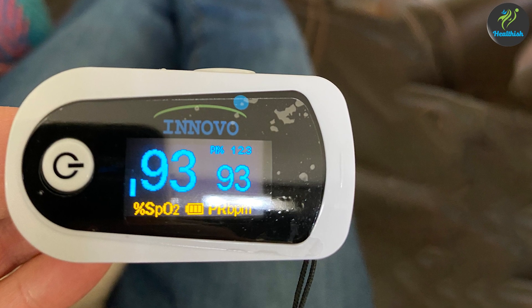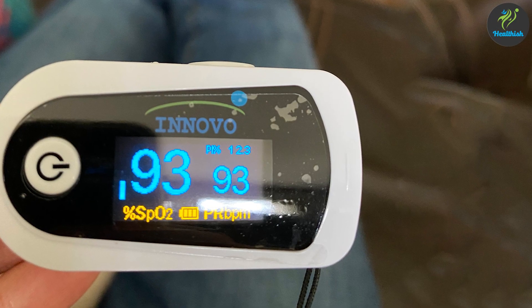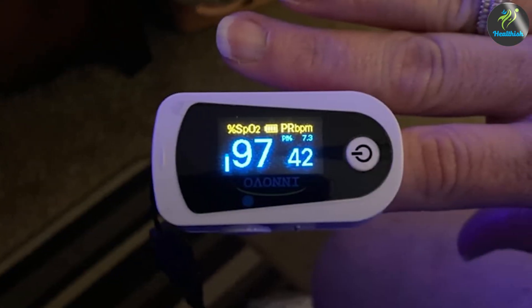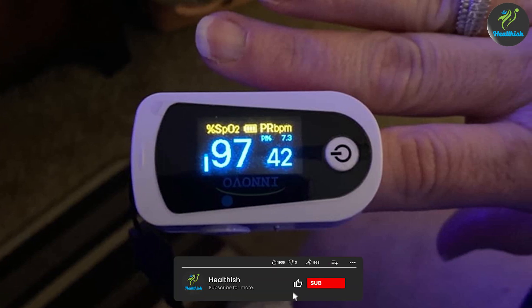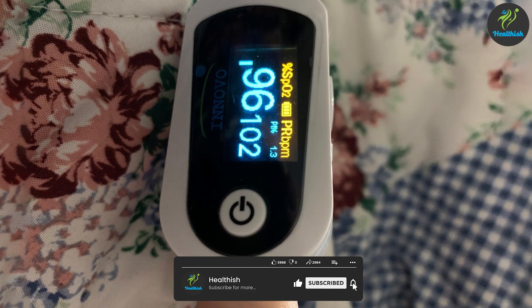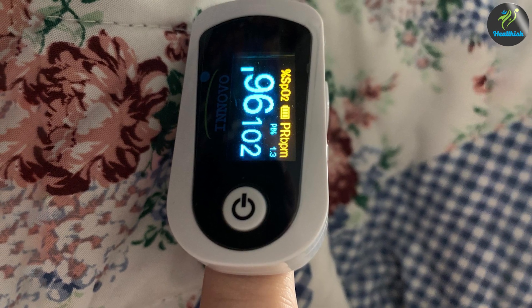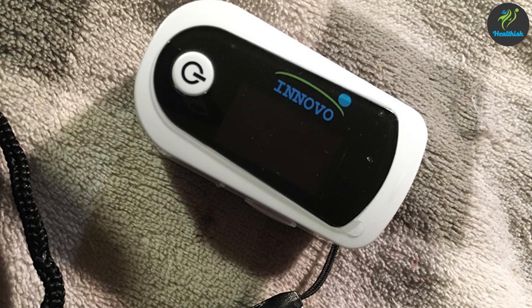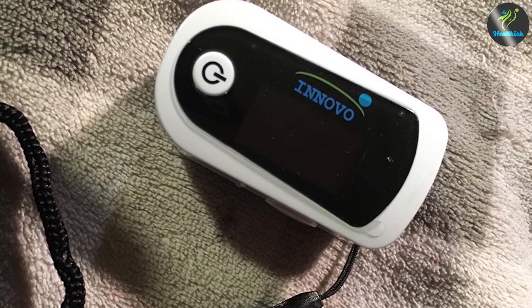The Innovo Premium IP900BP Fingertip Pulse Oximeter is a portable and user-friendly device designed to measure your blood oxygen saturation levels and pulse rate. This compact oximeter fits comfortably on your fingertip and provides real-time readings of your oxygen levels. Its simplicity and accuracy make it an essential tool for individuals looking to monitor their SPO2 levels confidently.